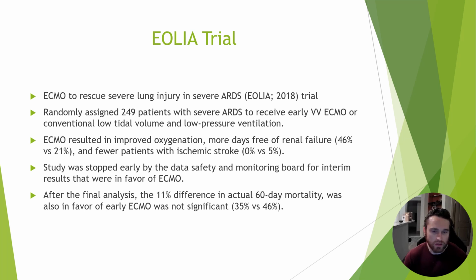ECMO resulted in improved oxygenation over mechanical ventilation, more days free of renal failure, 46% versus 21%, and fewer patients with ischemic stroke, 0% versus 5%. The study was stopped early by the Data Safety and Monitoring Board for interim results that were in favor of ECMO. After the final analysis, the 11% difference in 60-day mortality was also in favor of early ECMO, but was not significant, 35% versus 46%.